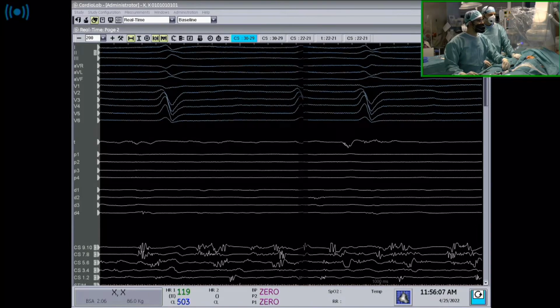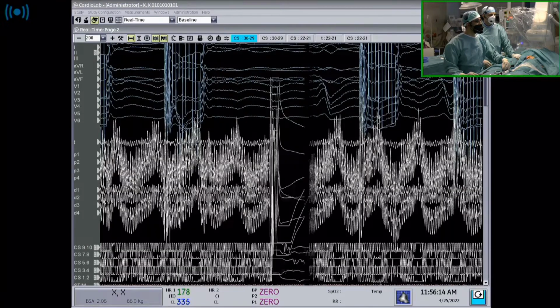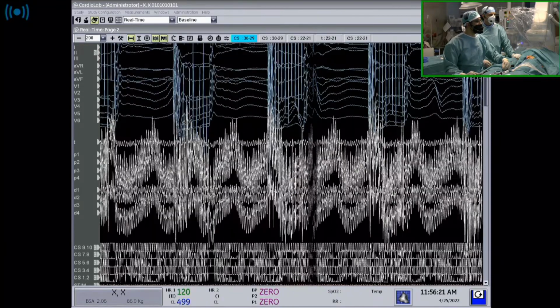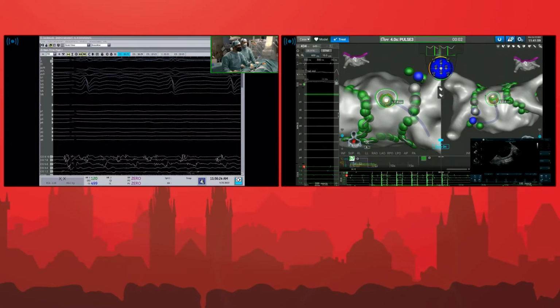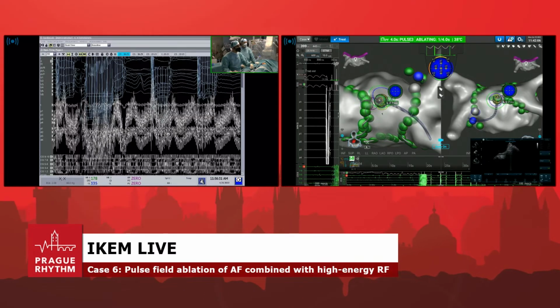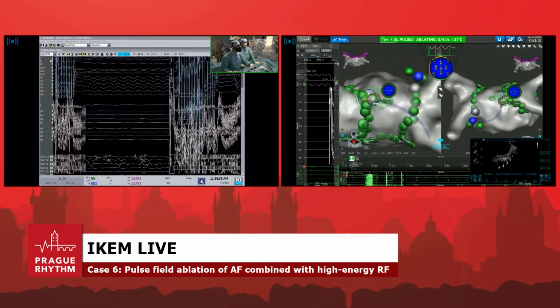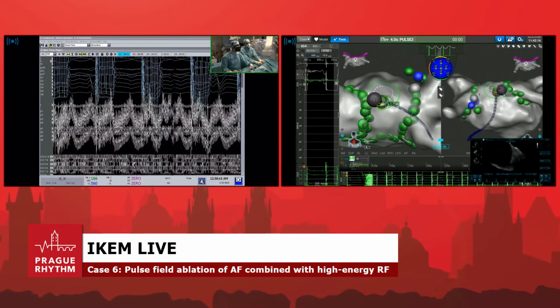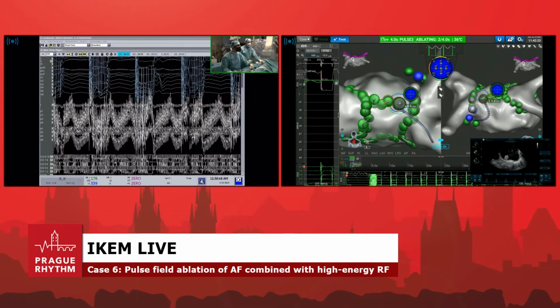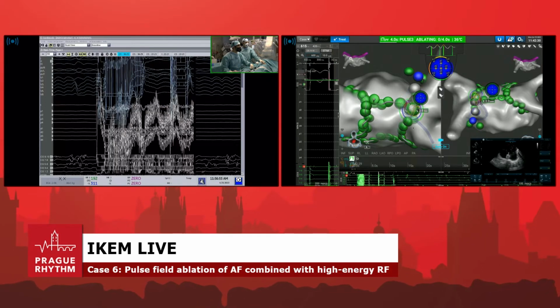So that's a superior line. Very good contact. Let's see. I think that's a better contact, this lesion. Before this spot, no potential. Yeah, because they are close to the previous posterior line. If you are close to the previous line, there is this collateral, how do you call that? The reversible damage. You don't see the signal in close vicinity of the previous lesion.